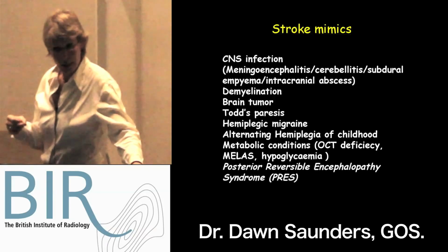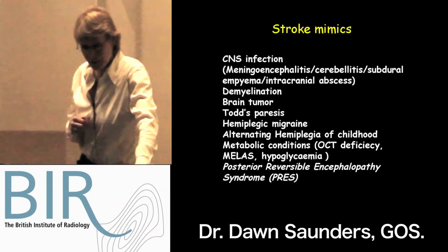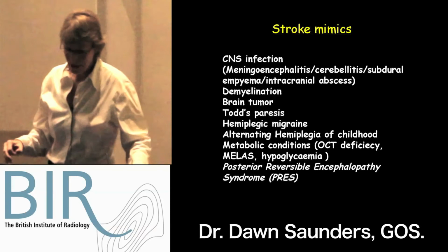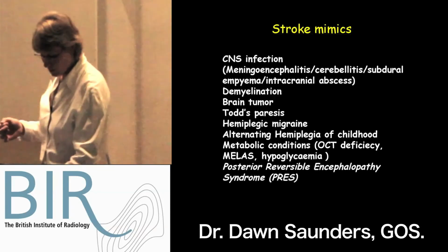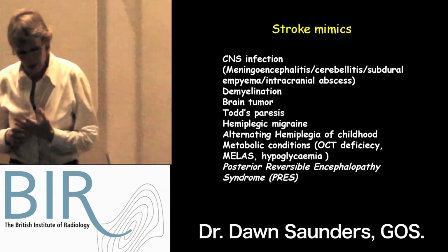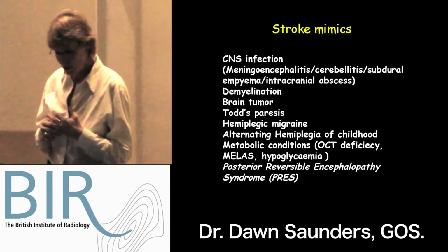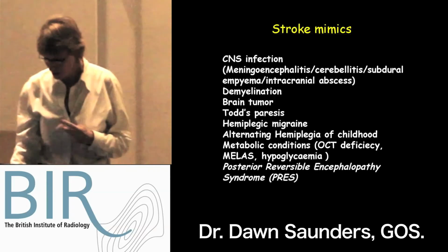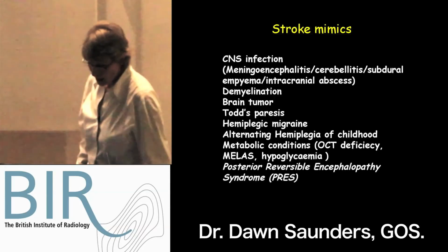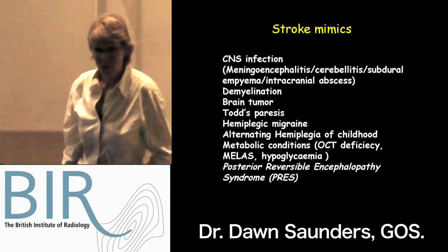It's very important to image the intra- and extracranial vasculature to establish the vascular cause, particularly in dissection and trauma. CTA can be used for arterial ischaemic stroke if MRA is not available, and MRV is useful if venous infarct is suspected. There is a role perhaps for perfusion imaging. We only use it in Moyamoya to look at revascularization, to look at perfusion following revascularization. And we reserve catheter angiography for cases with complex vascular disease or equivocal vascular disease.